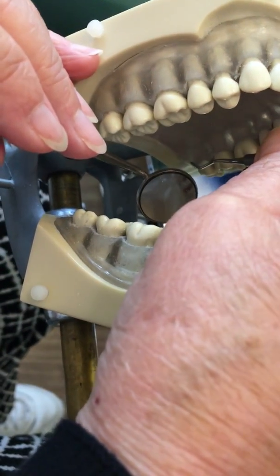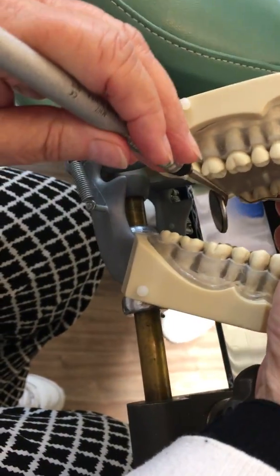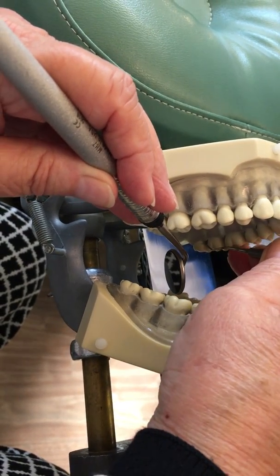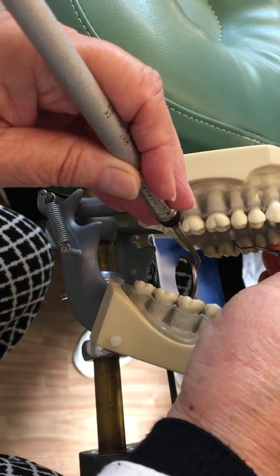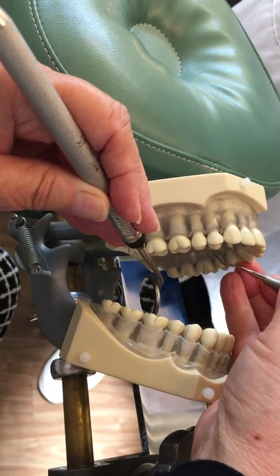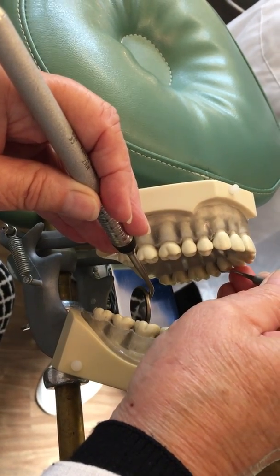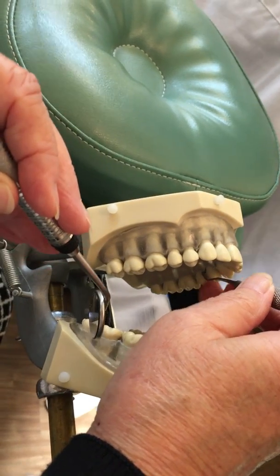I'm going closed and open, kind of hugging these bottom teeth with my palm — closed and open. My fulcrum is on the occlusal buccal line angle of the occlusal surfaces. It's not exactly on the occlusal; it's out more.